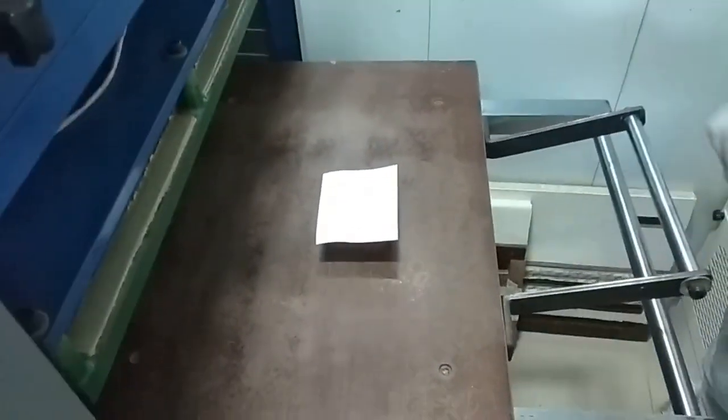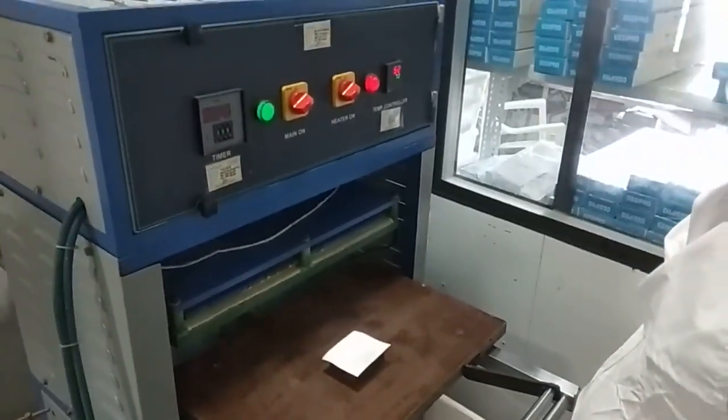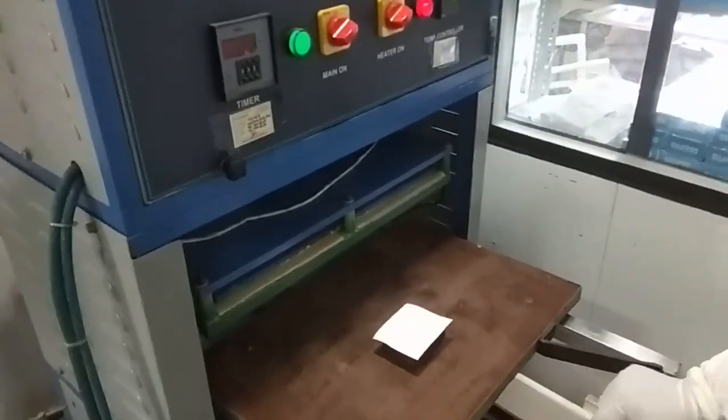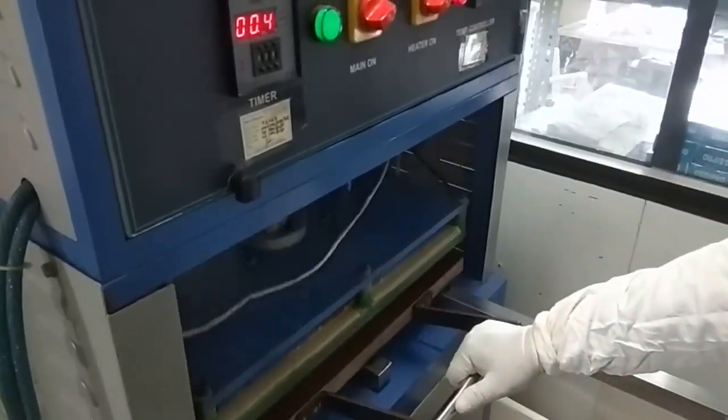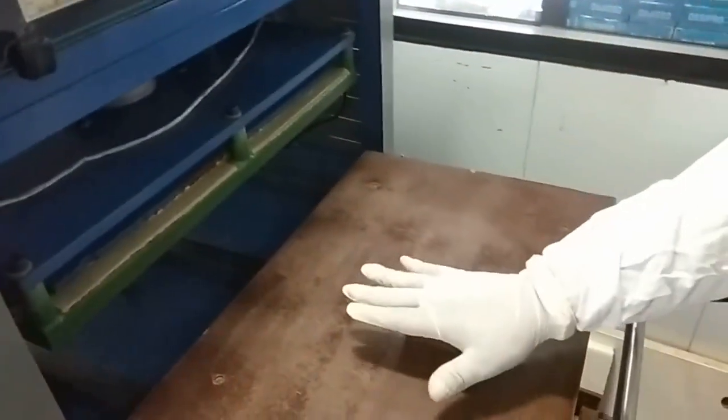Blister packing. Implants are packed in polyethylene terephthalate blister packs with one side medical grade Tyvek paper. Tyvek is hydrophobic, does not absorb moisture, and is also tear proof. Tyvek is more resistant to microbial penetration than other sterile packaging materials. The blister packing machine applies 4 ton pressure and uniform heat to seal the PET pack and Tyvek paper.